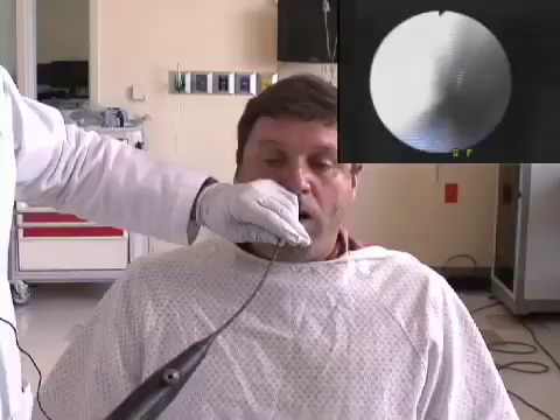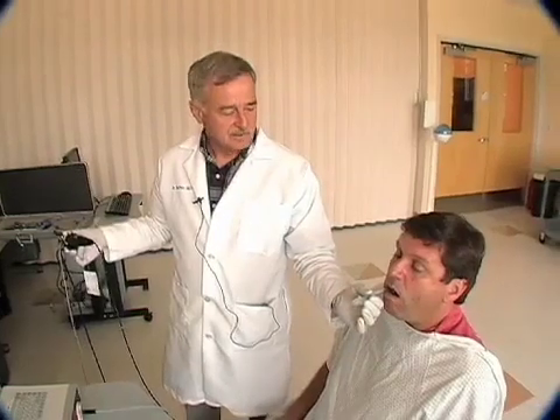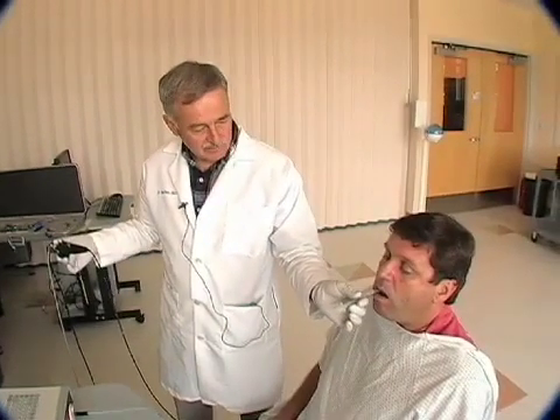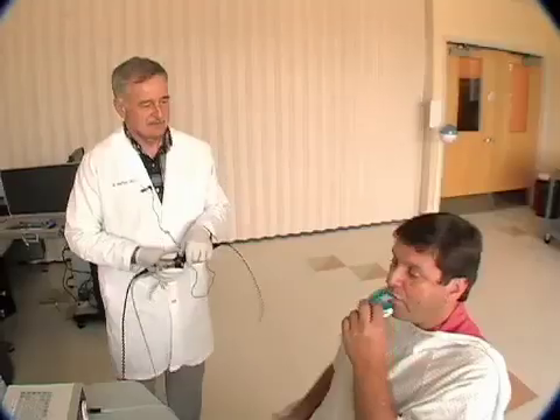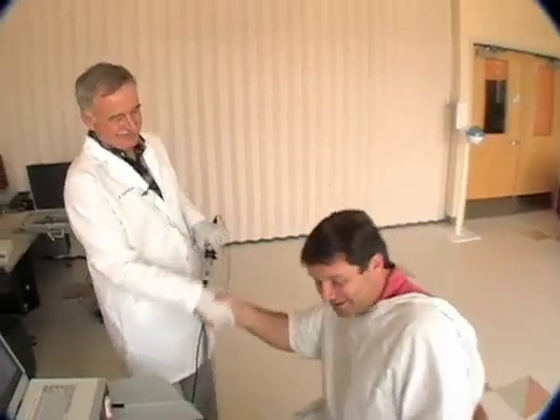He's coughing a little bit, but we've now secured a transoral airway using the Rotix device. Ben, I'm going to remove this right now. Here we go. Congratulations to the first patient — the first Rotix intubation.